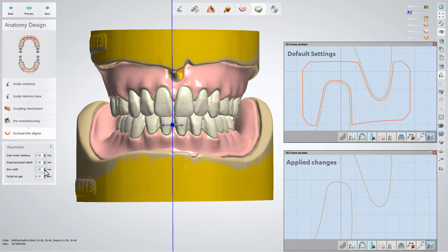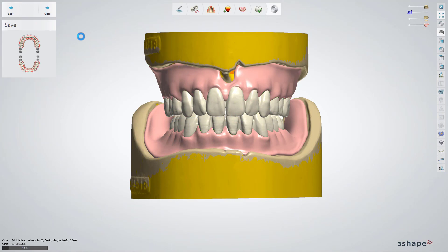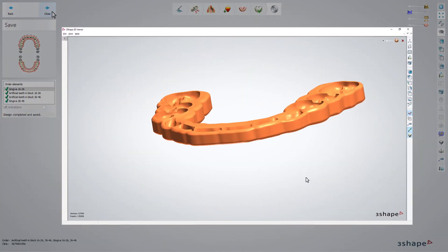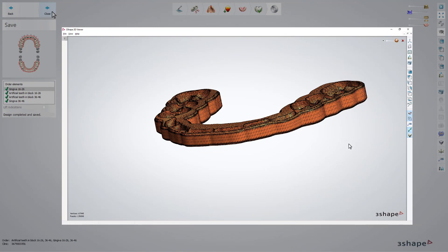If the parameters are set, proceed to the save step. You can check the output file before sending the order for manufacturing. You have now learned how to use the occlusal biter liner.